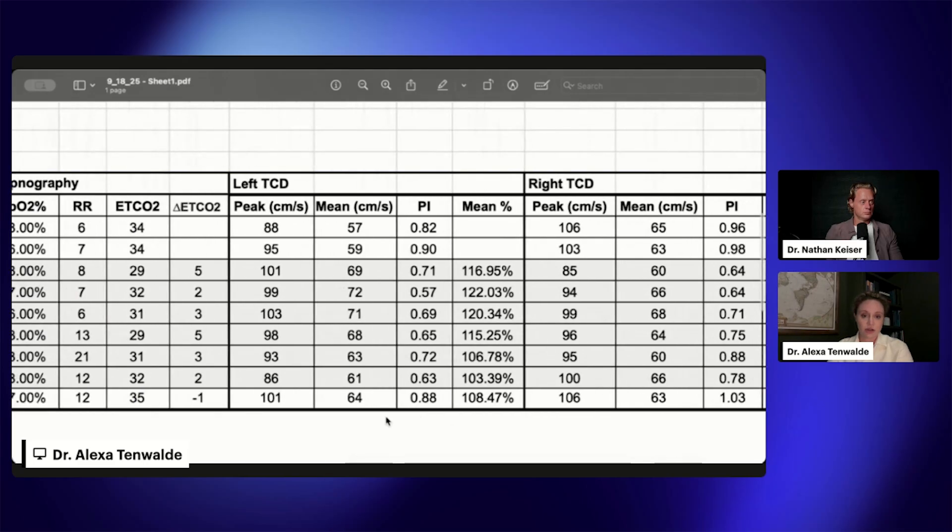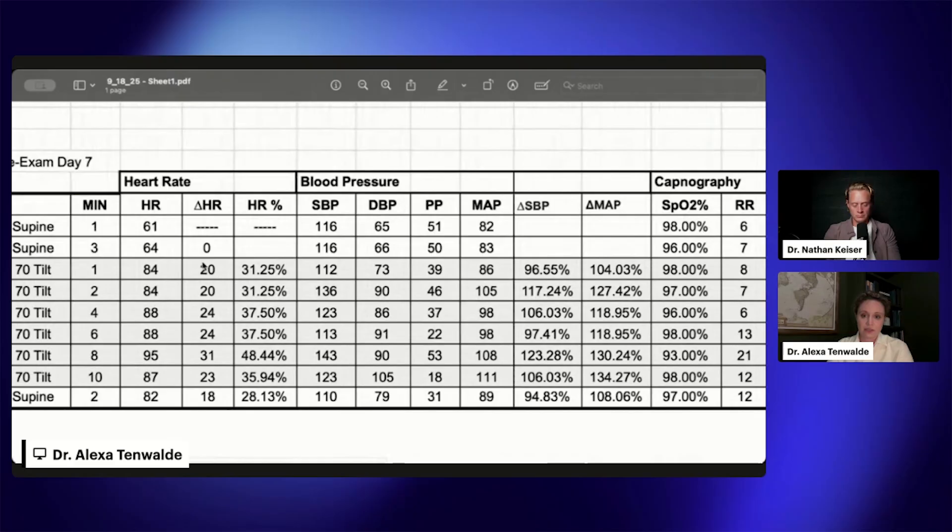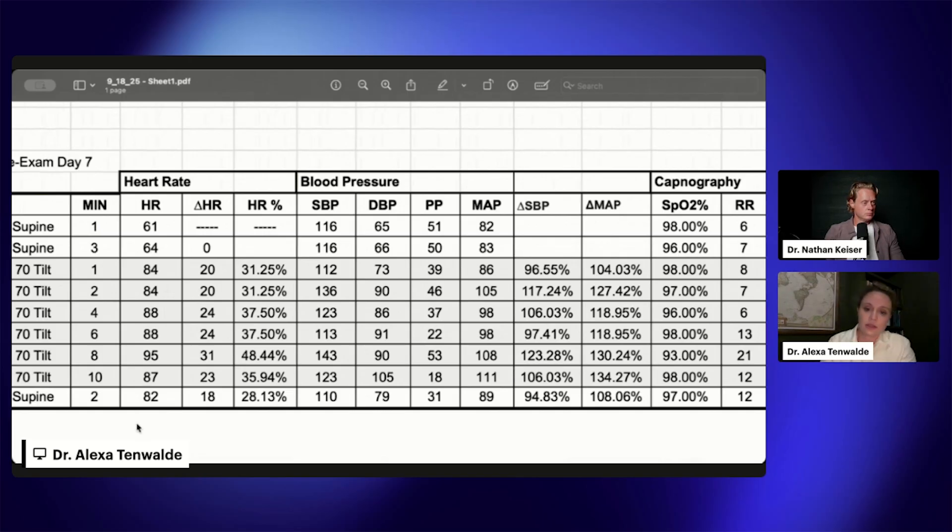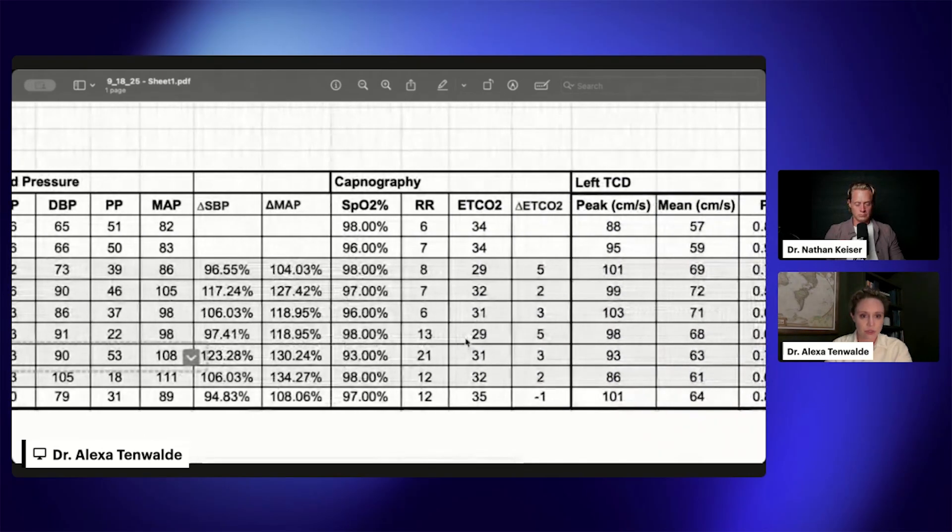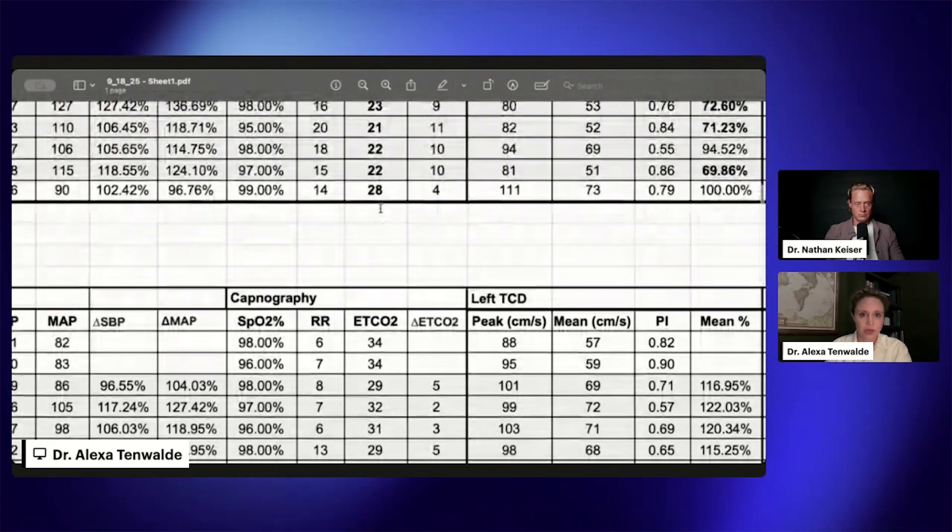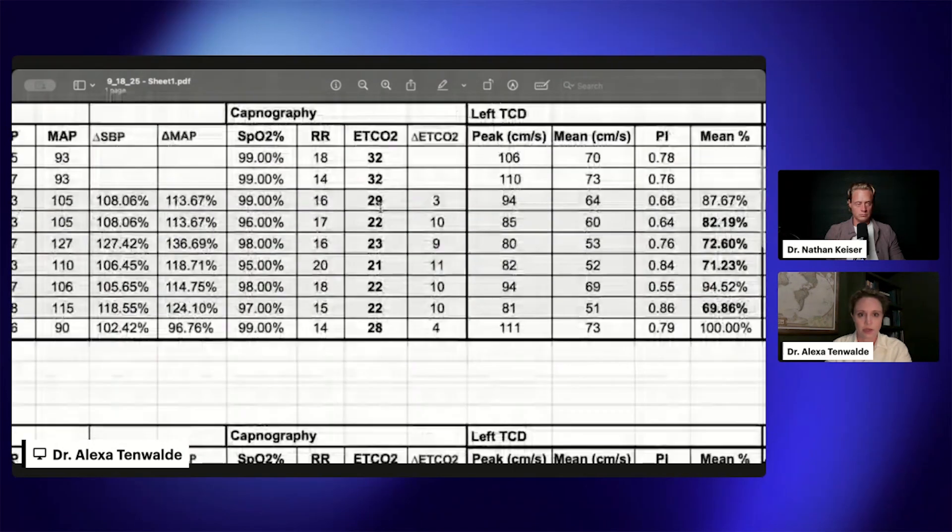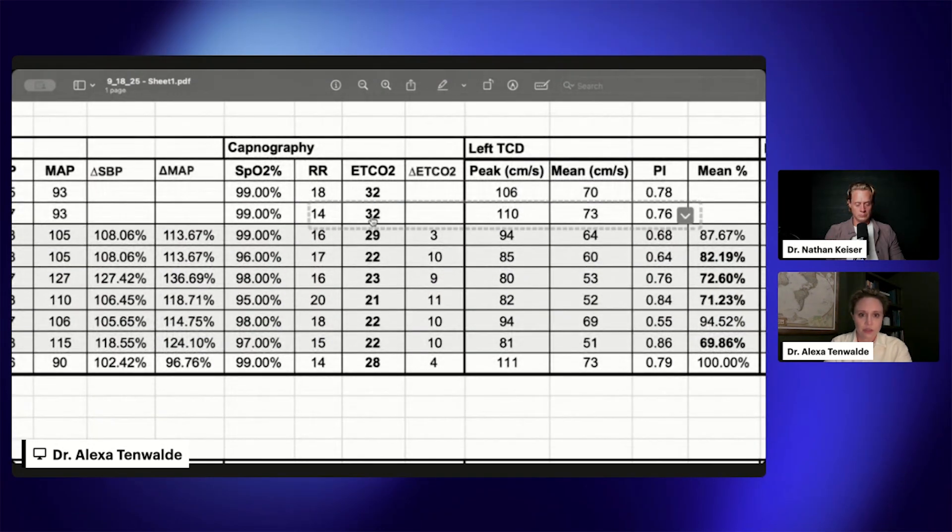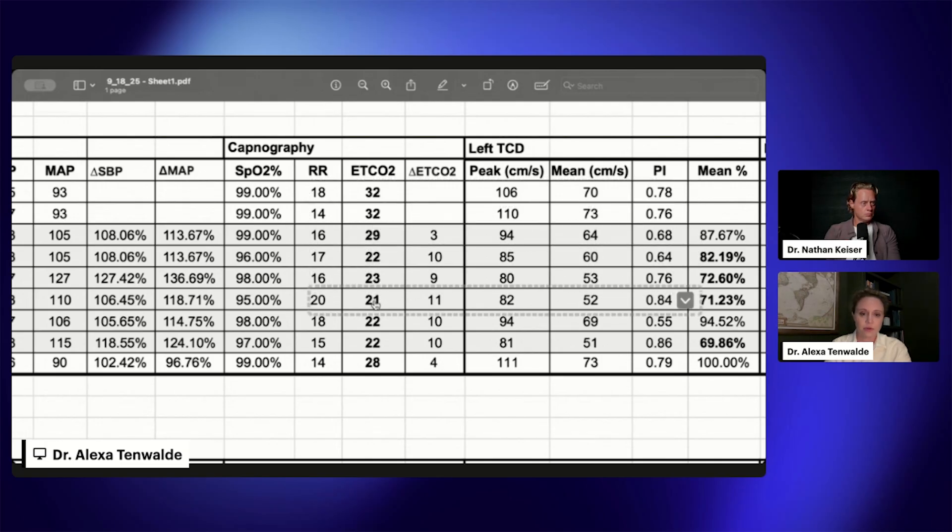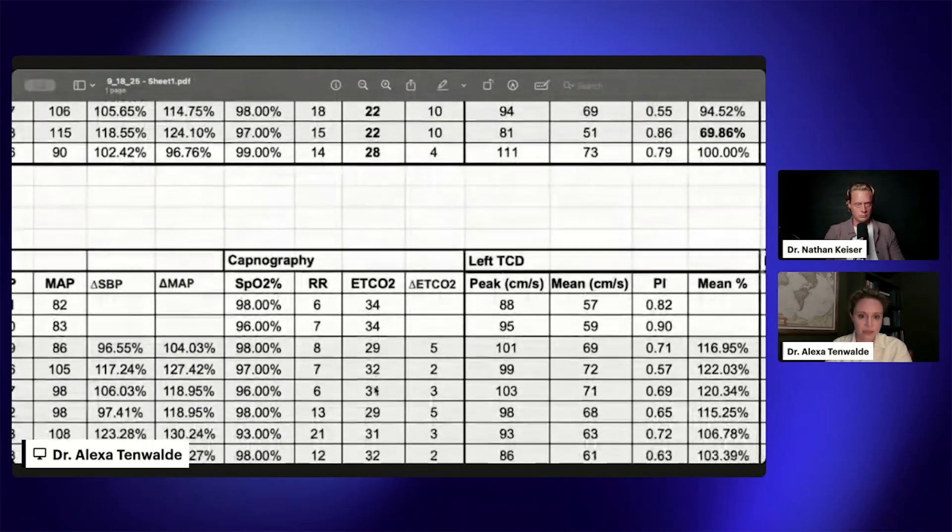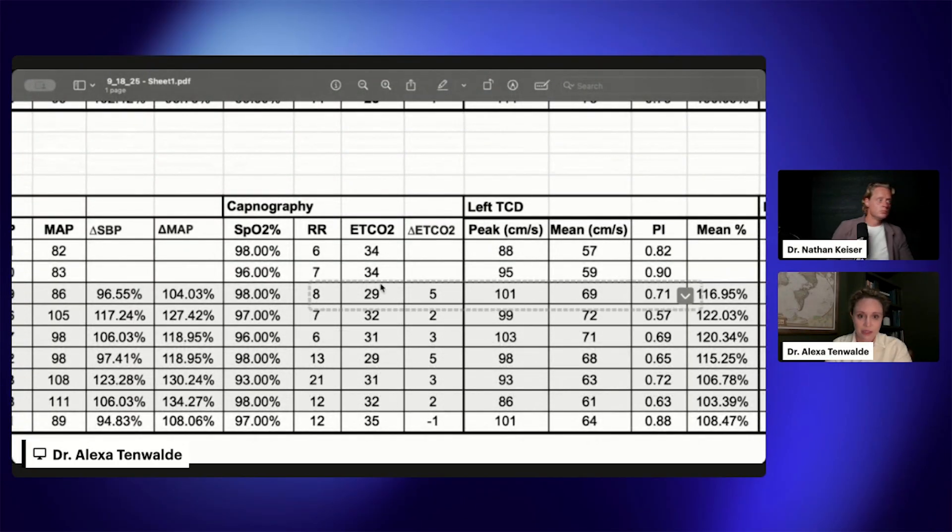And then also with that, we didn't have to have such a big compensatory heart rate increase. This is a good sign, showing that we're maintaining our blood flow. I also really wanted to point out those EtCO2 levels just because we talked about it last week on the stream. Her initial exam here, we can see we're dropping these numbers down into the low 20s, far too low. After seven days of treatment, I think we still have improvements to be made, but now we're hanging out high 20s, low 30s.